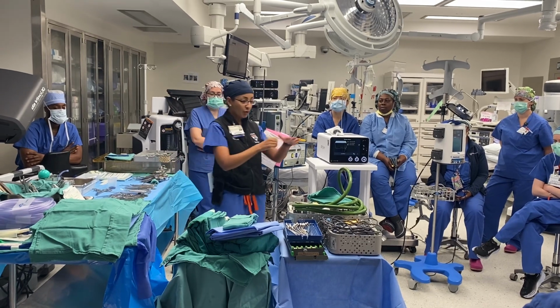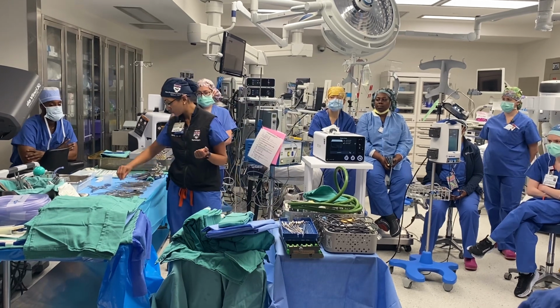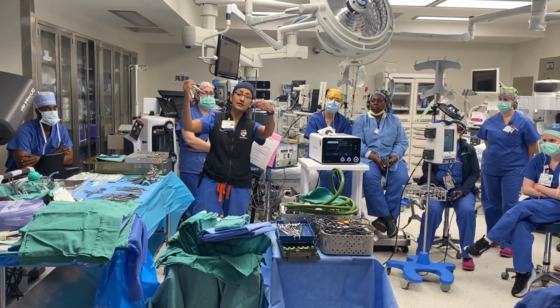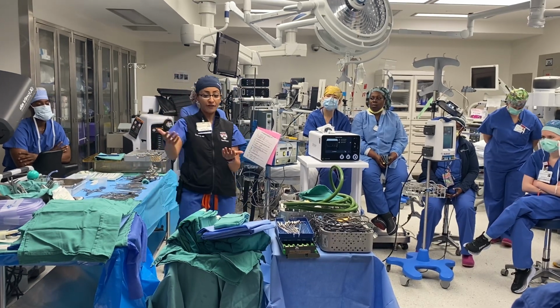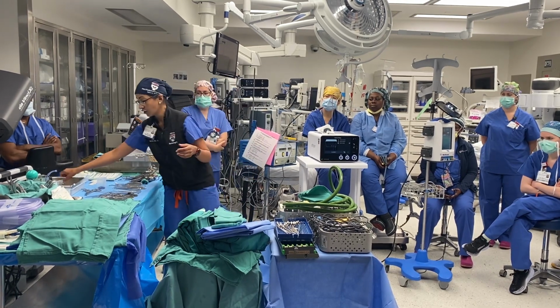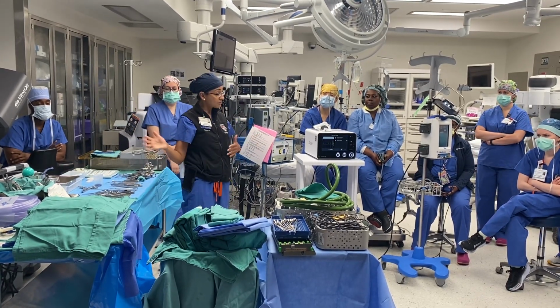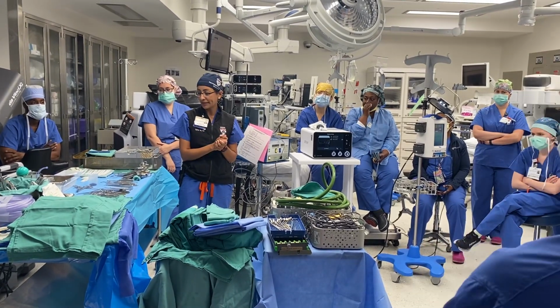So we'll hold that in place and drill that all around, and then we will typically take it off. So usually we're going back to that Penfield 3, which has that nice curve. Sometimes these smaller Addison periosteals allow us to really then lift up that bone flap off of the dura, which is that next layer. Okay, so that bone, by the way, goes nice and safely into one of these things so that it does not get lost. Sometimes we'll put it back, sometimes we won't. The surgeon will decide that based on how full the brain is.